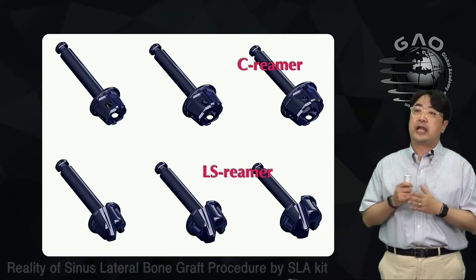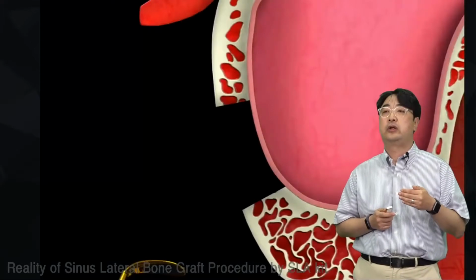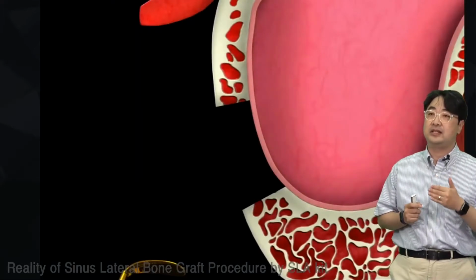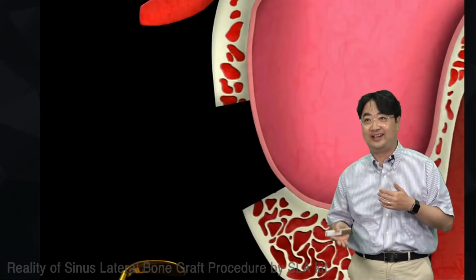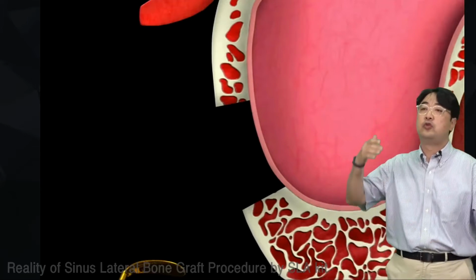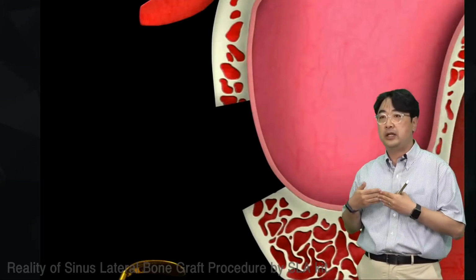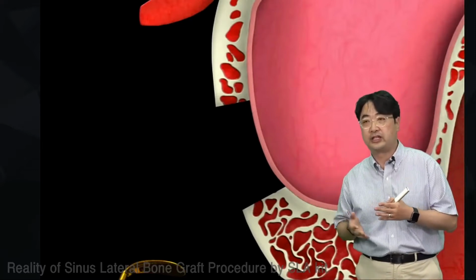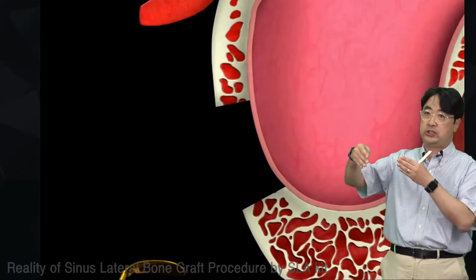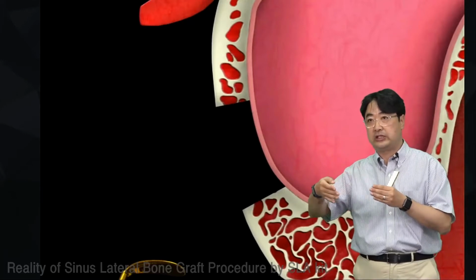Okay, so when you do the sinus graft, you have to do the membrane dissection, right? We call it the Freer elevator, F-R-E-E-R, which means you make the membrane free, right? It acts differently from the curette, right? With the curette, you have to dig out, so you have to pull toward your body to remove the granulation tissue or anything. But with the Freer, you have to push. It's a big difference, right? So you cannot pull it down, you have to push it out.